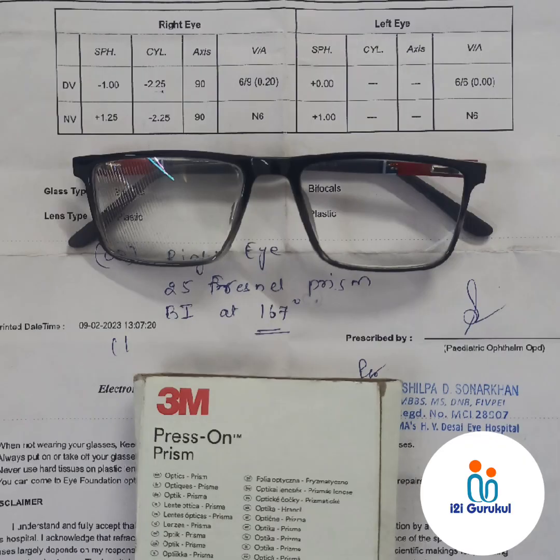Dry it properly and clean the prism with a lint-free cloth. Keep it for drying for three to four hours, and then it will be ready for final dispensing.